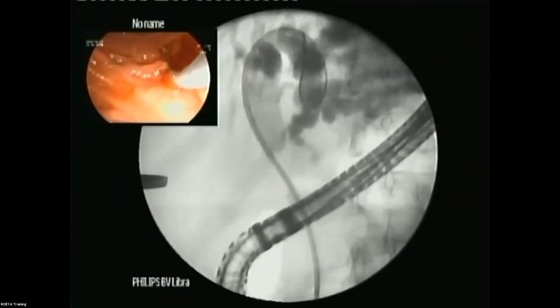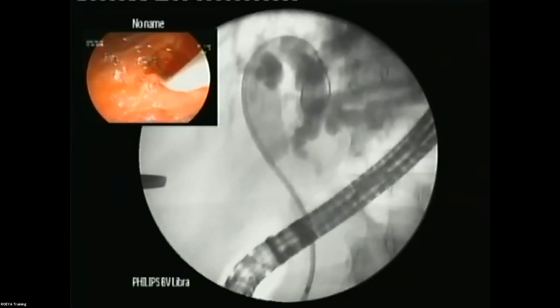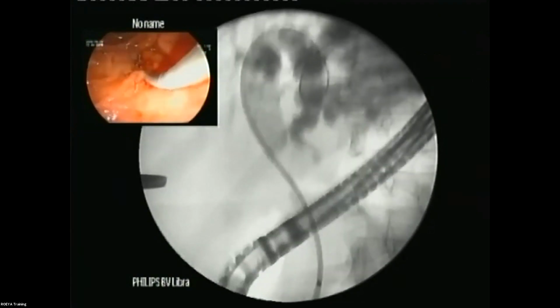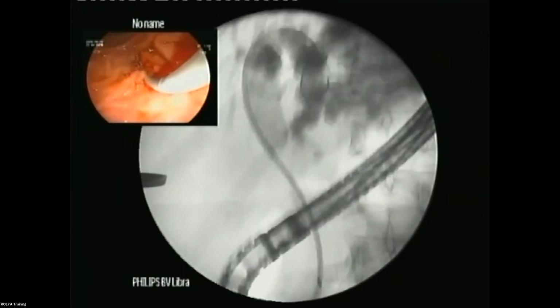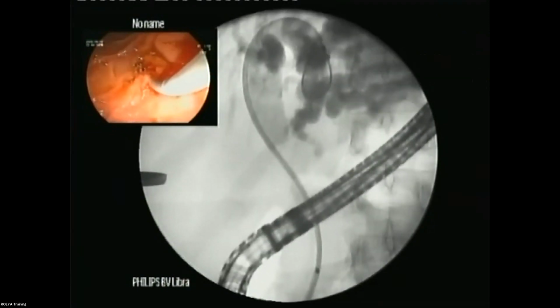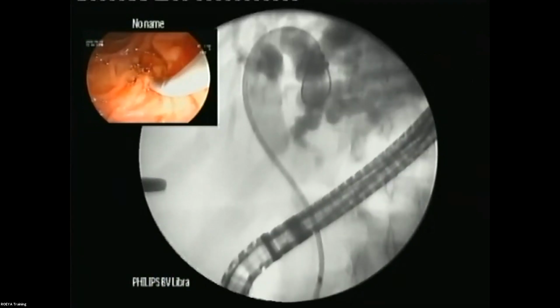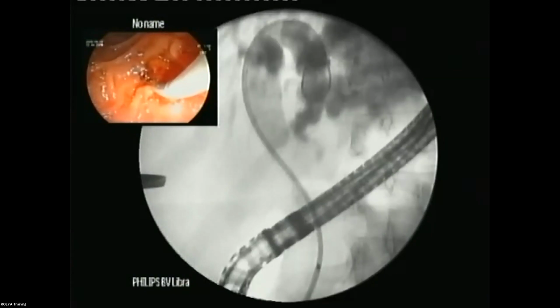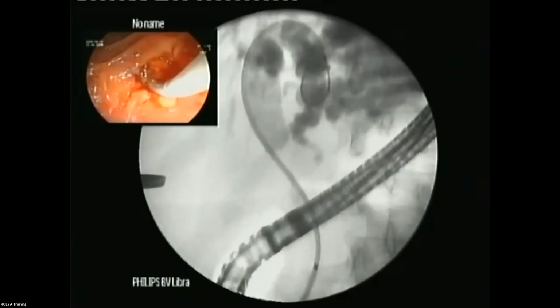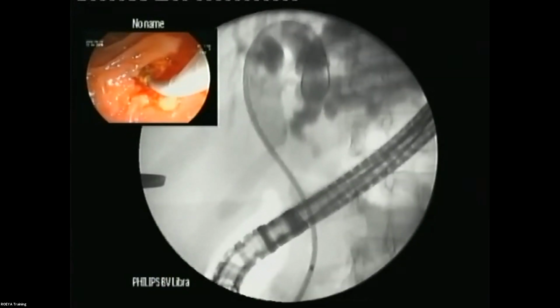Hani, you like to see the distal end of the stent? Yes, okay. So now, once I'm here, I can see the distal end of the stent. We cannot see it on the endoscopic side. The radiological part, here in the radiology, you can see the distal end. Very good. I will depend completely on the endoscopic view. So you can see here now the distal end of the stent, and it's well in place. And I prefer to leave at least about 1 centimeter of it outside the papilla. That's right. So now we'll start.